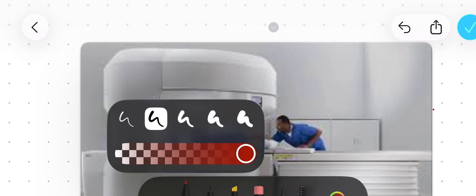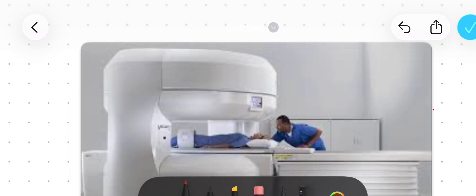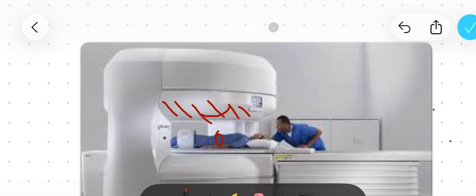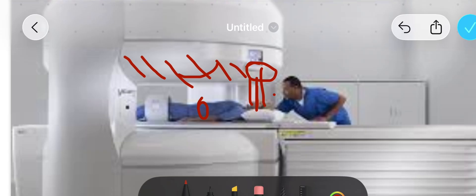You don't get to have it your way all the time. If you have something that is going to be imaged, that something has to be in the middle. That means your head is probably going to be somewhere around here. You can still look to the sides, but you see how this is shaped — kind of like a concave shape — that means your direct line of sight is on top of the magnet. So it's not 100% open, because your line of sight means you're going to be like the ham or cheese in a sandwich — right there between this plate and this other plate.